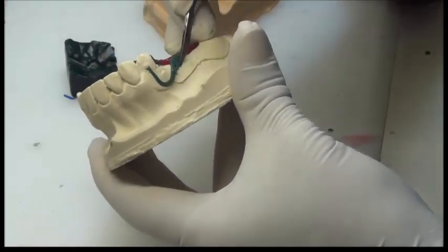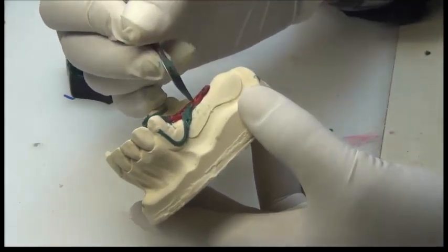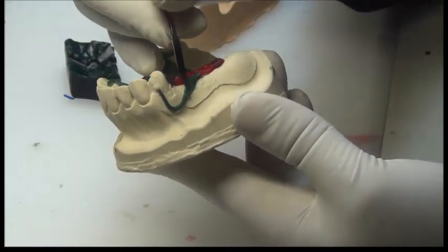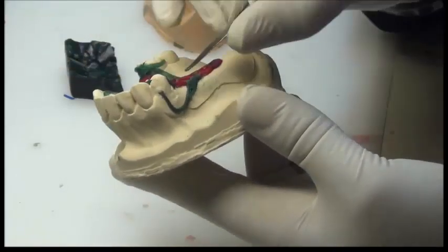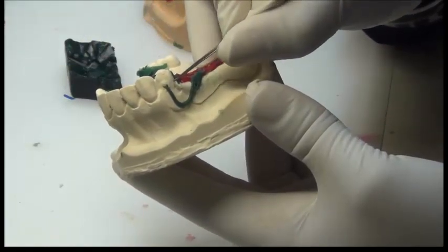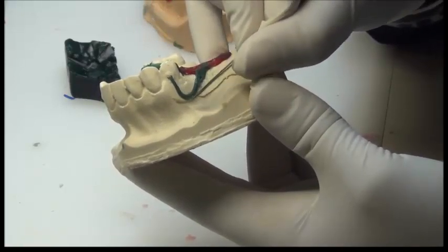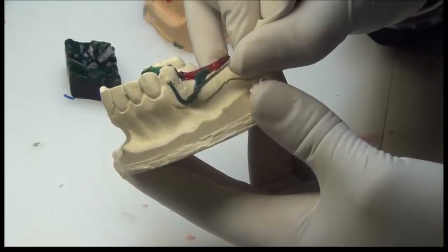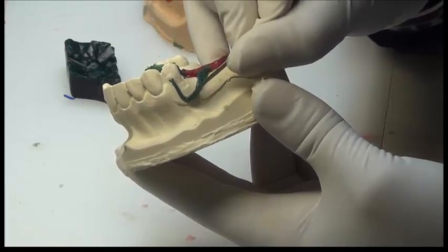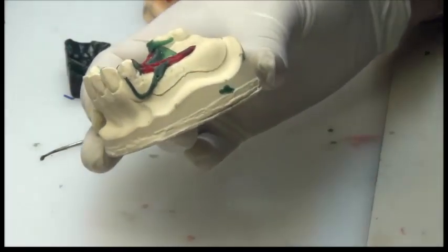So here is our I-bar clasp. It originates from the minor connector here, the grid work, which is the open lattice here, and goes downward to the sulcus. Once reaching the tooth, it goes upward toward the open window. The distance here should be around 3 millimeter to the gingiva, and from the gingiva down to the bend should be 5 millimeter. So the whole distance should be around 8 millimeter, in this way.